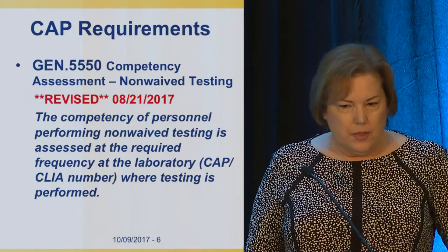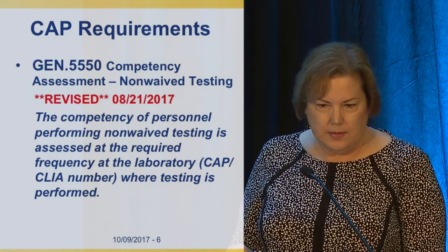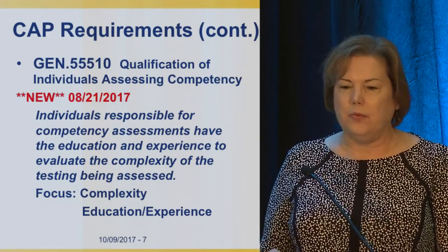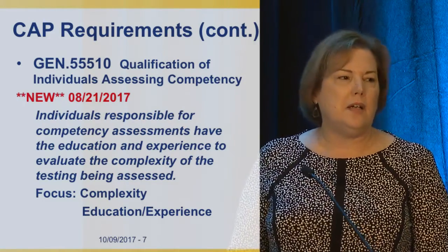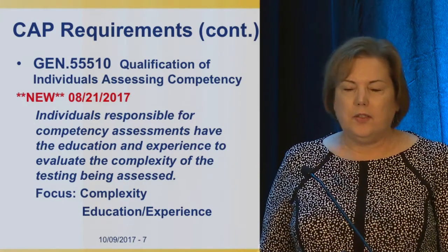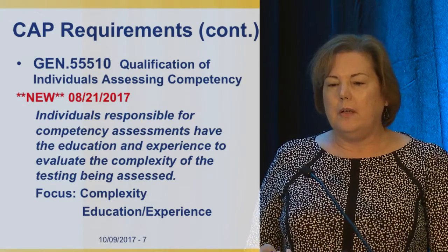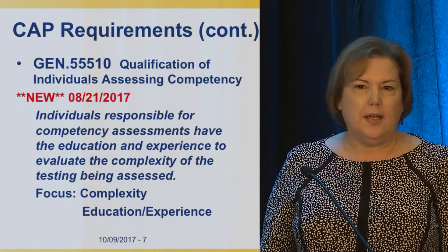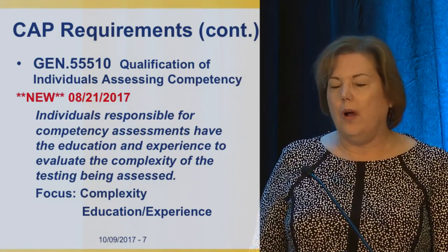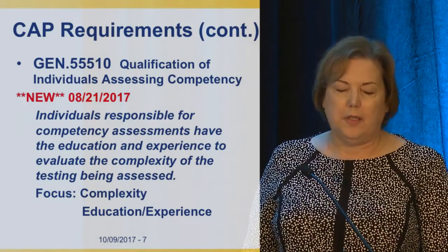So now I wanted to talk about the other requirement in the general checklist, which talks about the qualifications of the individuals who are actually assessing the competency of your testing personnel. So, and I'm not going to read this to you, but I thought I just wanted to focus a little bit on the complexity of the testing as it's defined by CMS, and also touch on what I think the education and experience requirements mean.